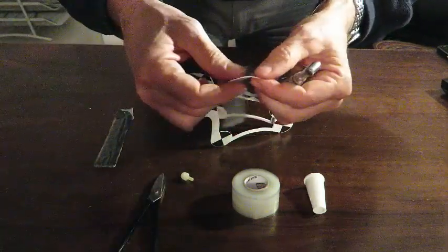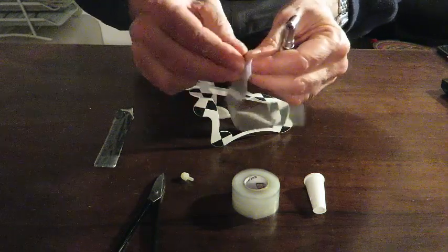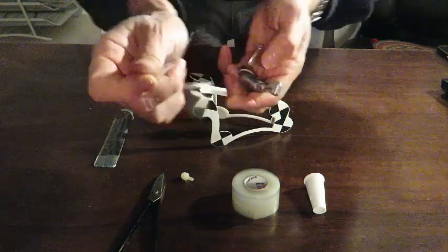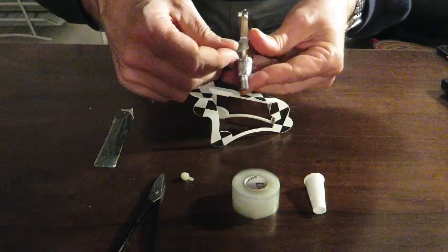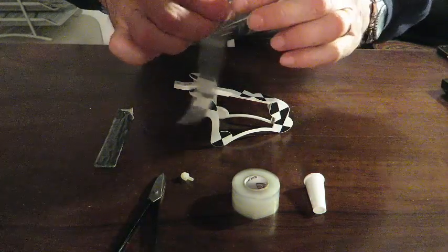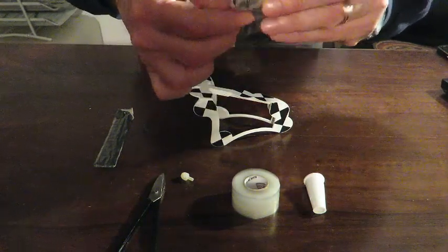Then, after cutting 20 cm of the silicone, we will peel the silicone out. What we are going to do is roll the silicone 360 degrees around the adapter.